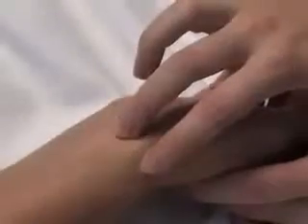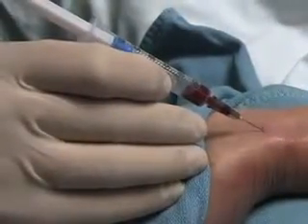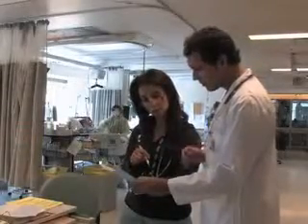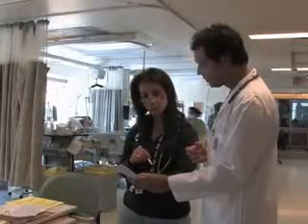With the appropriate technique, radial arterial puncture for arterial blood gas analysis is a skill easily mastered by medical trainees. A more detailed approach to acid-base disorders and hypoxemic respiratory failure, while necessary, is beyond the scope of this instructional video.